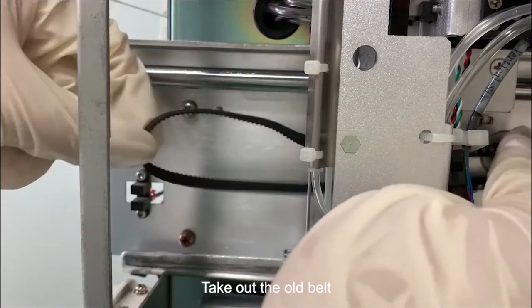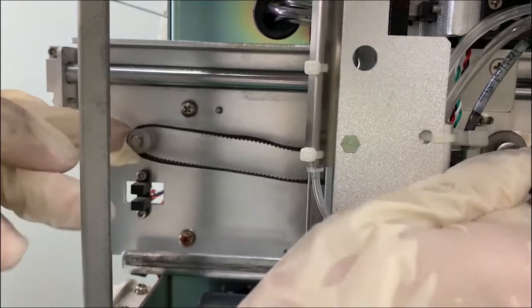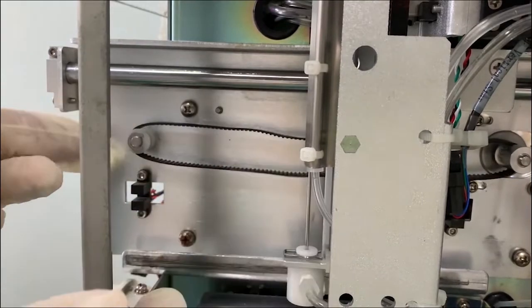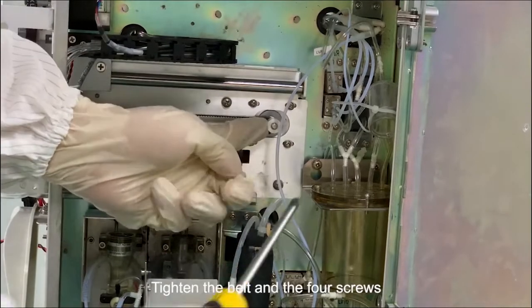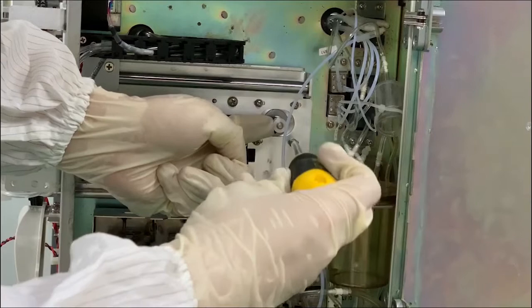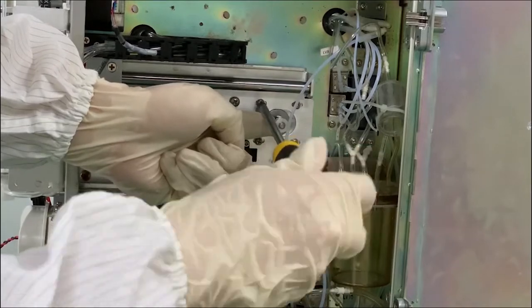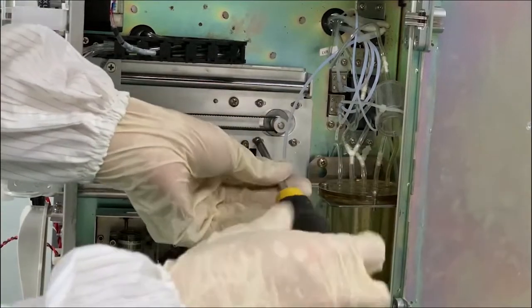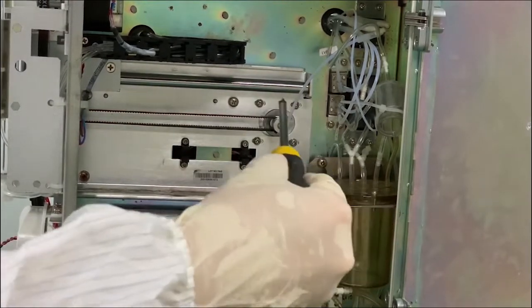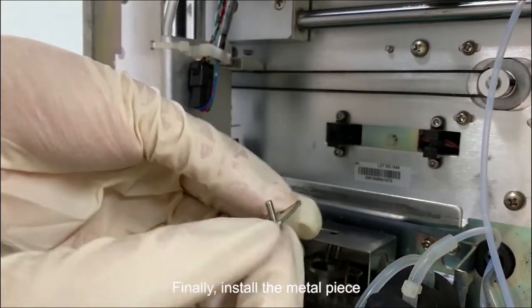Take out the old belt. Replace it with a new one. Tighten the belt and the 4 screws. Finally, install the metal piece.